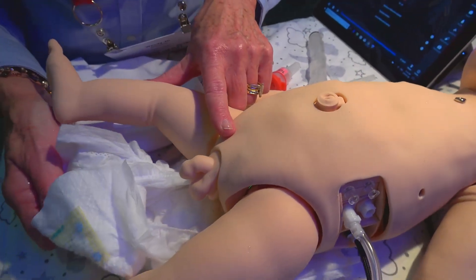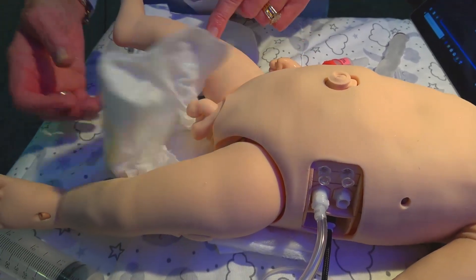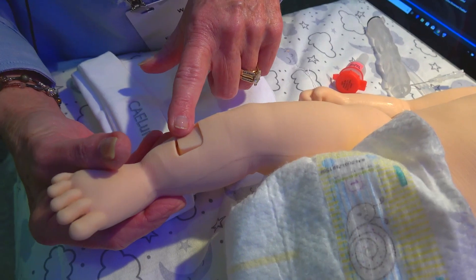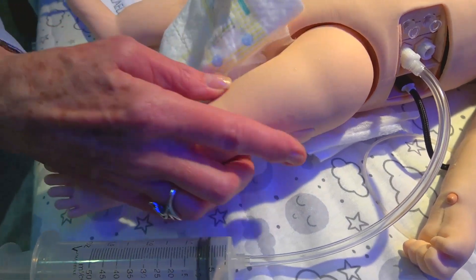For genitalia, we have male and female options that Luna comes with, and also a urine reservoir so you can catheterize and get fluids back. On the right leg we have an IO site, as well as bilateral IM or sub-Q injection ports on both of the thighs.